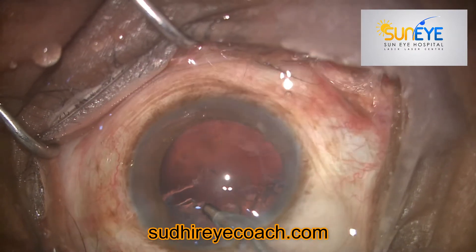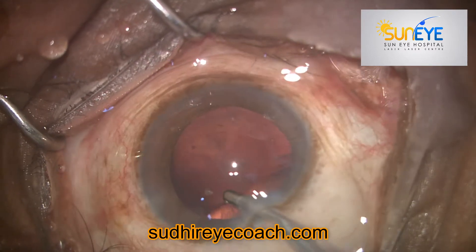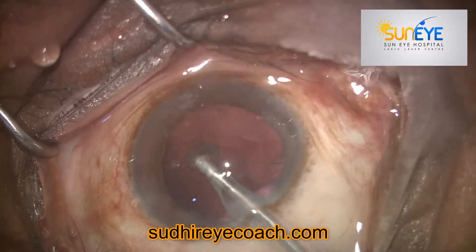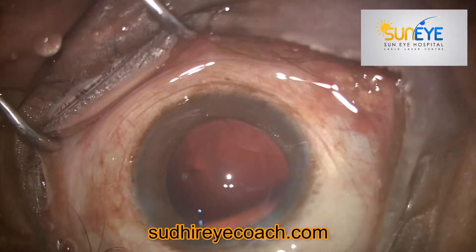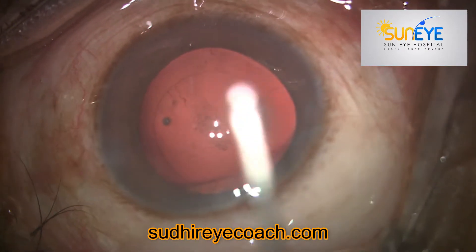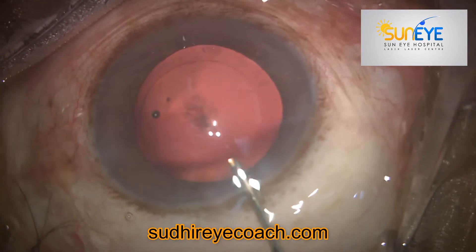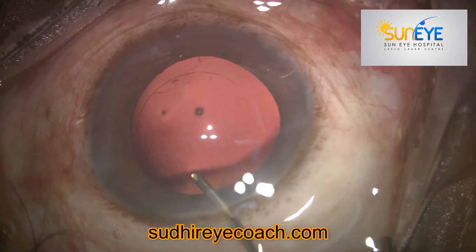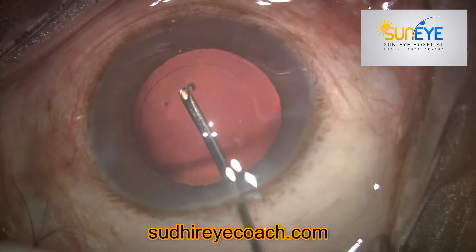Today I'll be showing a very simple technique that I have been using for almost a decade without any complications. In this case, you can see there is a plaque present on the posterior capsule. With the help of a fluid flush — by directing fluid parallel to the posterior capsule — you can flush out any loose plaque, fibers, and cells.